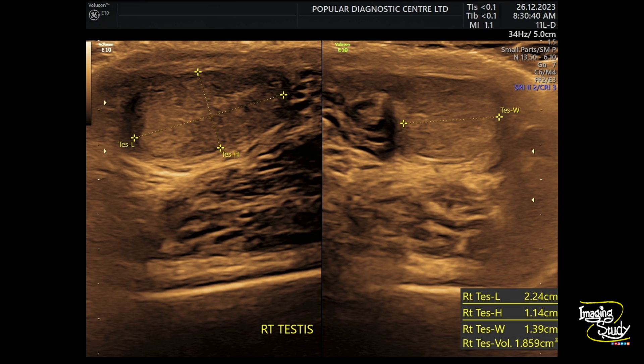Here you can see the still picture of the right testis in longitudinal and transverse sections. You can see the testis is small in size and heterogeneously hypoechoic.